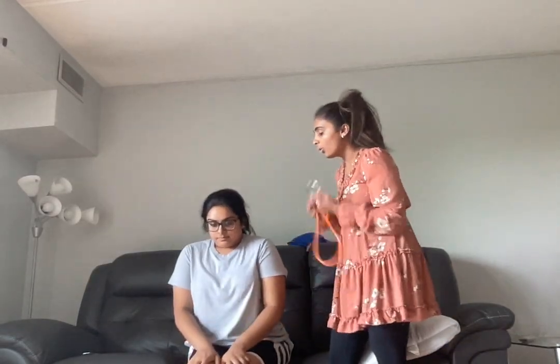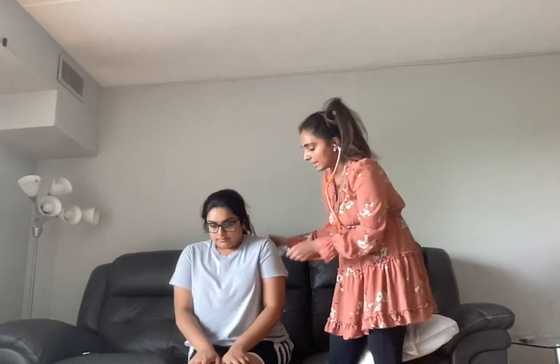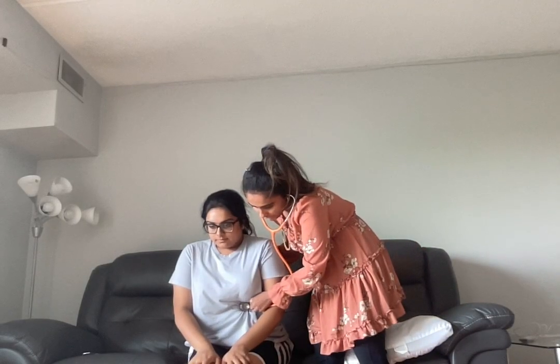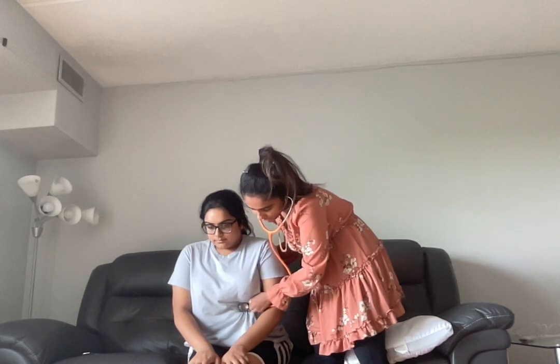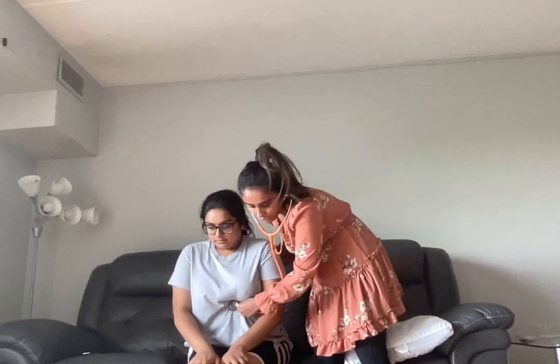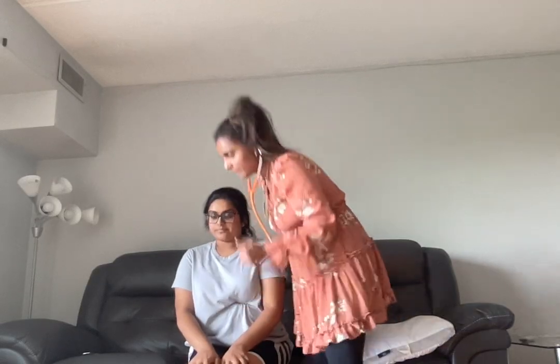I'm going to have you sit up and lean forward. Exhale for me and hold your breath after expiration. Exhale. And no aortic regurgitation heard. I am listening for that on the left sternal border. Okay? And now with this, we conclude our cardiac assessment.